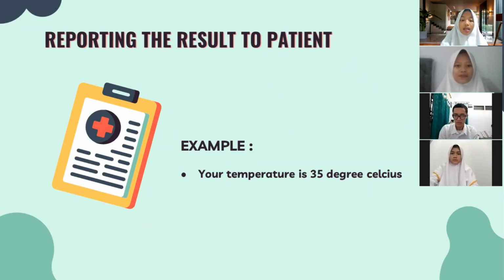After finishing measuring, you can close it. And then I have a video about how the temperature check is carried out by the nurse. Please watch it carefully.